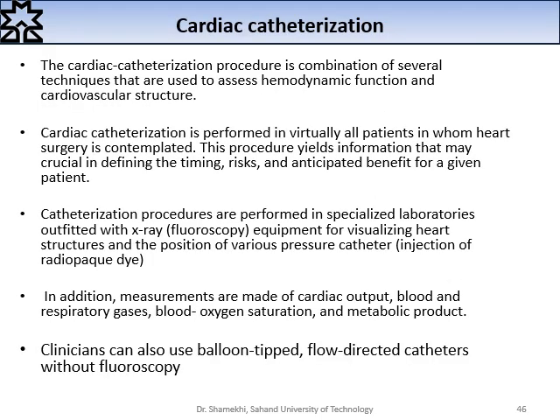The next important subject in cardiac surgical is cardiac catheterization. The cardiac catheterization procedure is a combination of several techniques that are used to assess hemodynamic function and cardiovascular structure.